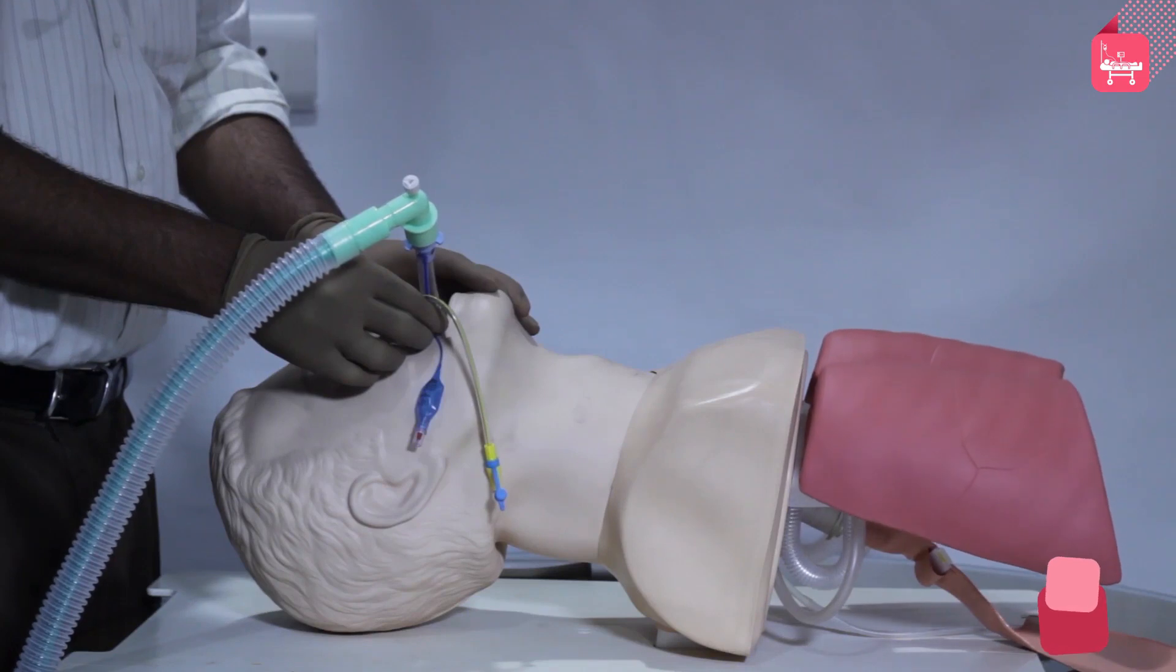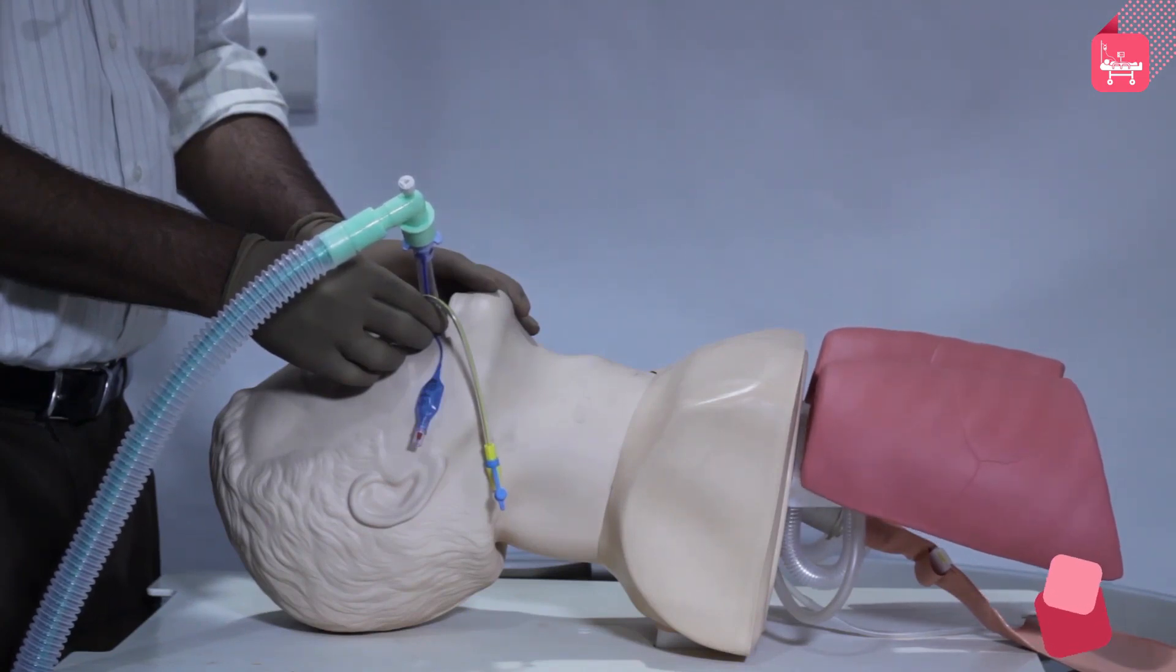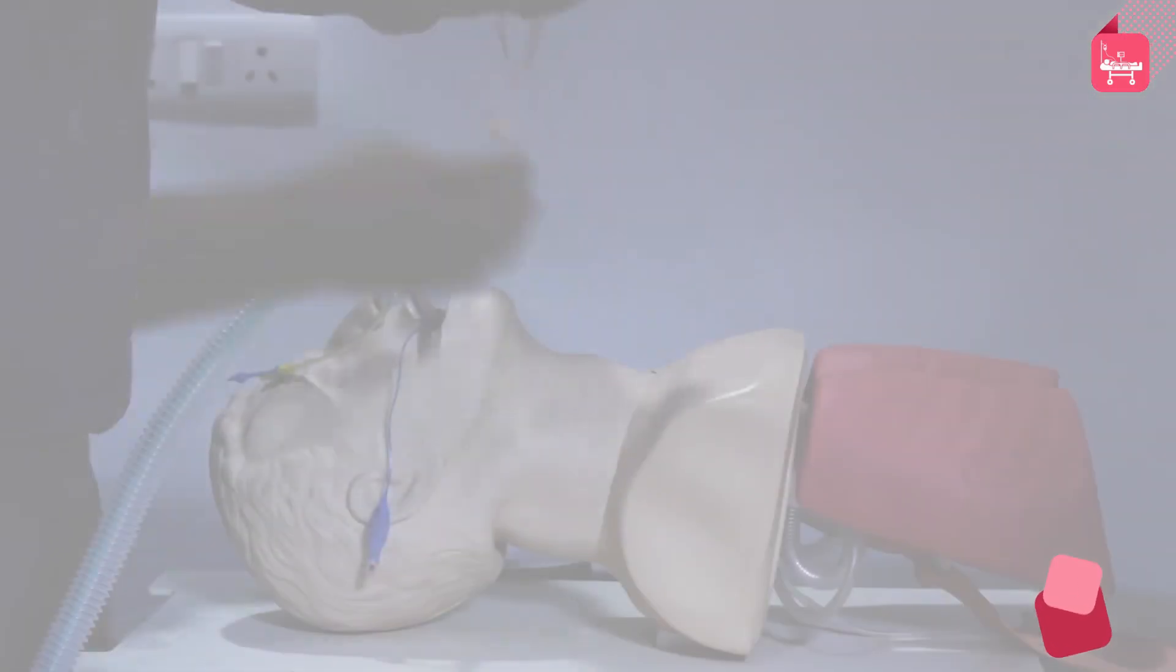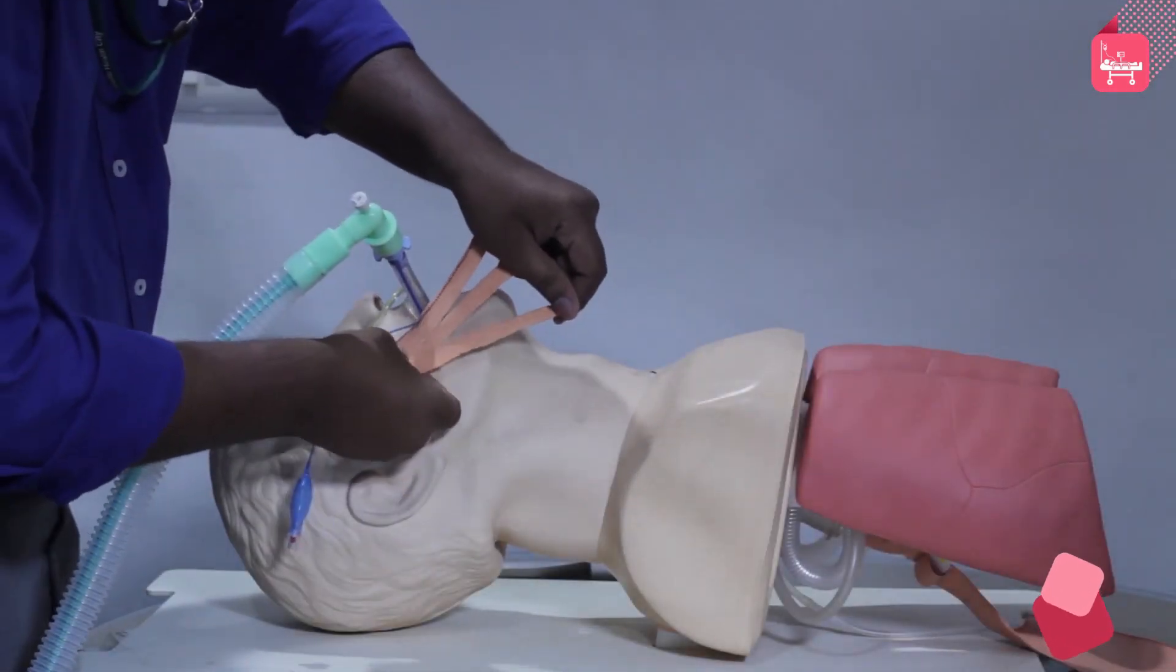Ventilate the patient: attach the tube to the breathing circuit. Ventilate the patient at a rate of 10 to 12 breaths per minute. Securing the tube: secure the ETT using adhesive tape.